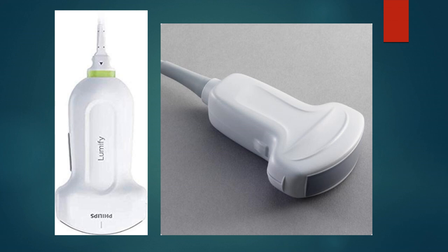So on this big picture, I hope this little thing works. Let me know if that doesn't show up, because I'm going to use the pencil just to make sure that it does. So this right here, and then it also gives us a secondary one right here to say, hey, this side of the transducer should always be pointing upward in sagittal or coronal and should always be pointing to the patient's right in transverse. This one is going to be right here. So you can see how they look a little bit different from each other.